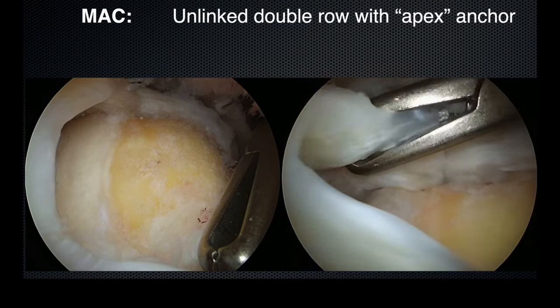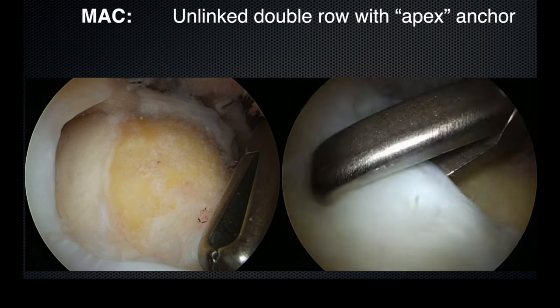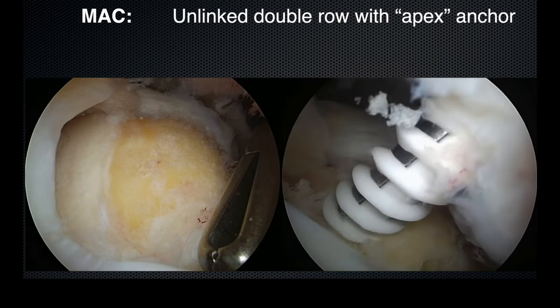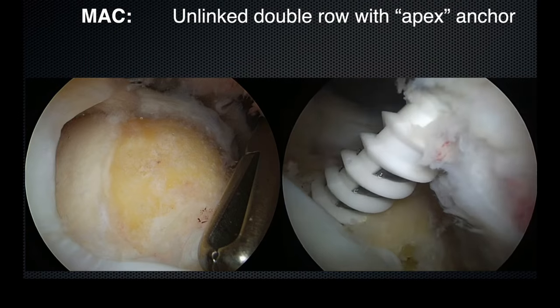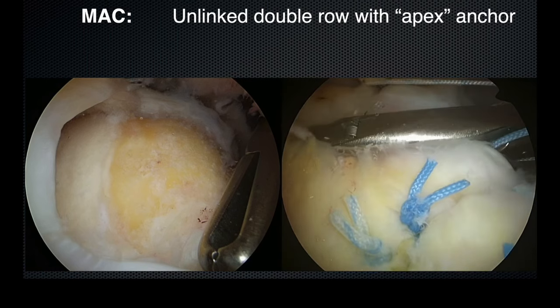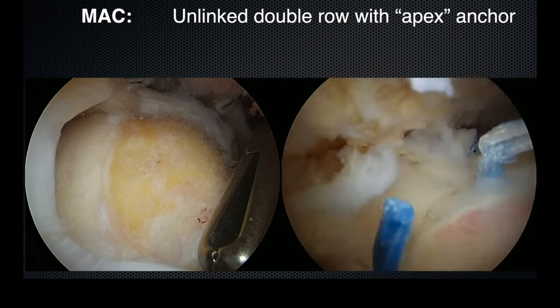In this complex tear, we can see the anterior supraspinatus does not reduce anatomically after the posterior cuff is repaired. The decision is then made to insert some ripstop sutures and perform a single row repair of the remaining anterior cuff.